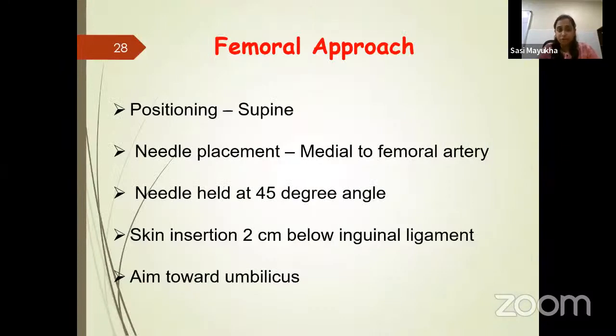Next is the femoral approach. So position is supine, needle placement is medial to the femoral artery. Needle should be held at a 45-degree angle and skin insertion should be 2 centimeters below the inguinal ligament. And you have to aim towards the umbilicus.